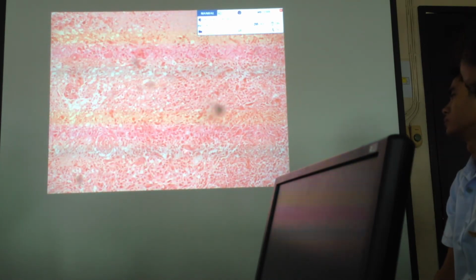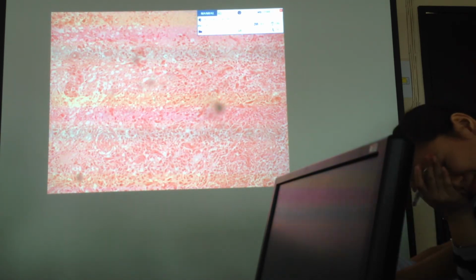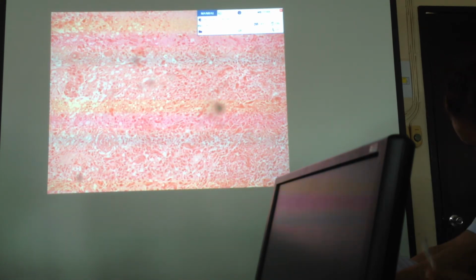Yeah. And then you have the smaller cells there. Okay. Small round nuclei with scanty cytoplasm. Okay. So that's the cytotrophoblast. And then you have the intermediate. Okay, if you have small nuclei but you have abundant cytoplasm, okay, yung parang naging in between siya, that's the intermediate trophoblast.